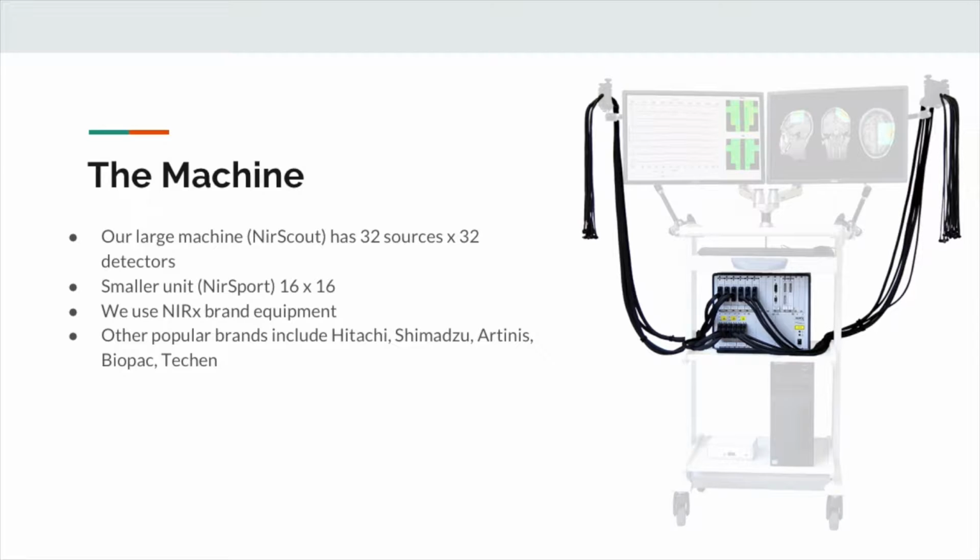I know we've only had ours a couple of years, but I was wondering what they tell you the general lifespan of this kind of equipment is. I have no idea what the lifespan is, and I don't think they really know. Our serial number is 32. There aren't that many that have been made so far. And actually, we might be one of the labs, at least for NIRS, that's running ours the hardest. So we've had some wear on the equipment, and I think we are a big test case for them from an engineering perspective: how durable is their equipment and how can they keep improving it?